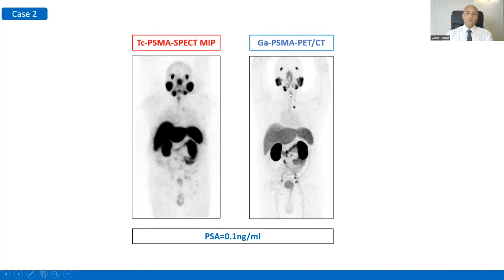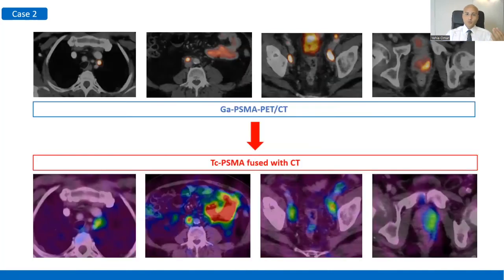So from the volume of the images, of course, the lesions are more clear. Now we can see the superior mediastinal node here, as well as the abdominal, as well as the pelvic node, of course, easily seen in the gallium. But again, when we see the cut sections, both of the lesions are almost seen. So that's the upper row, that's the gallium images, and these are the same images that we've just seen.